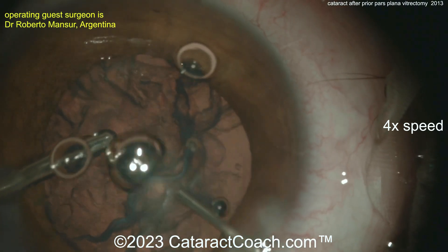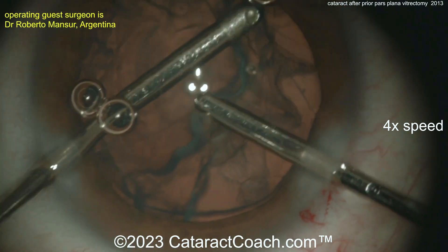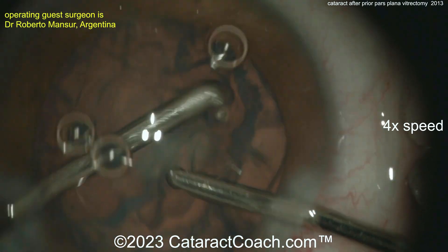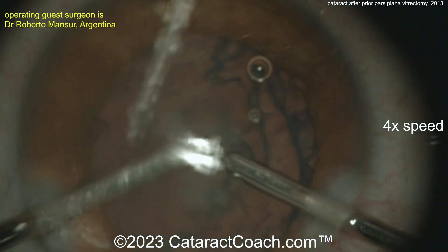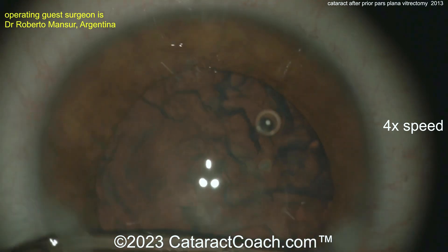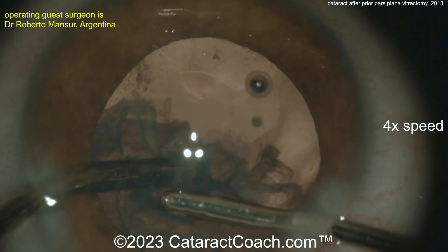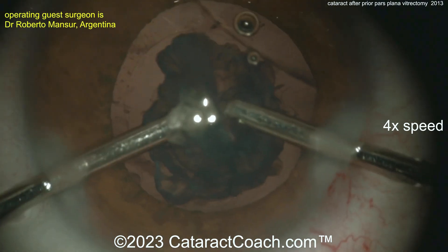We've sped up the video here so we can get through it quickly. The surgeon is going to switch hands, put a little viscoelastic in to not let the AC collapse — which is a good idea. The aspirator is now in the left hand, with good access going all around 360°. You want to bring the lens material up and get it away, because if the posterior capsule opens up, remember you could very easily drop lens material into the vitreous cavity. The patient had a full pars plana vitrectomy, so there's no vitreous left — the back of the eye is filled with aqueous — and as a result, the whole thing can drop very quickly. So get it up out of the capsule bag into the anterior chamber, then just aspirate it down.